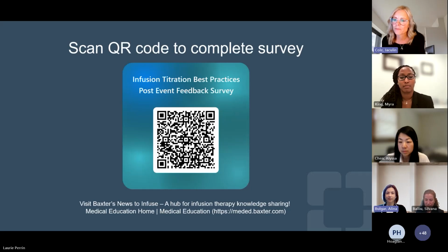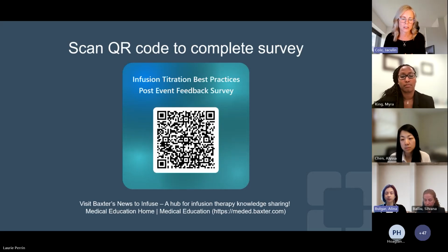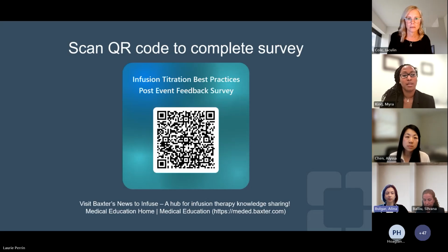And our last question, how do you handle a patient rolling into the ICU from either the ER or the OR on a moderate dosage of a pressor or sedative? So the receiving nurse obviously wouldn't start at the lowest end of the range order, but would continue at the rate running when they receive the patient. How do you manage order compliance around that?